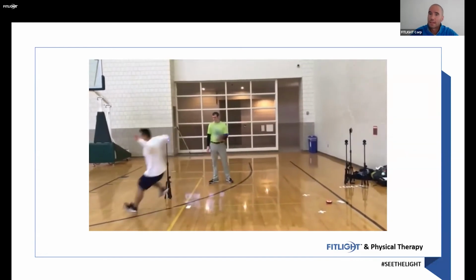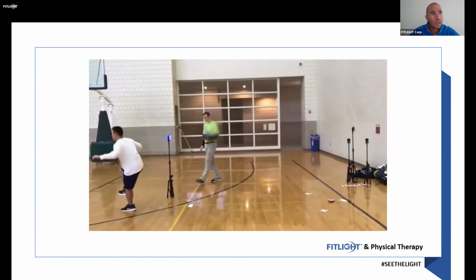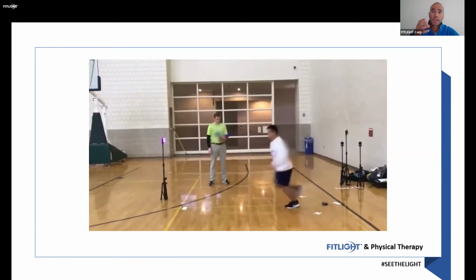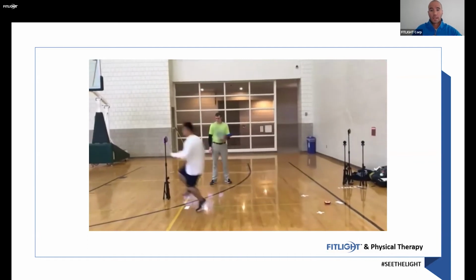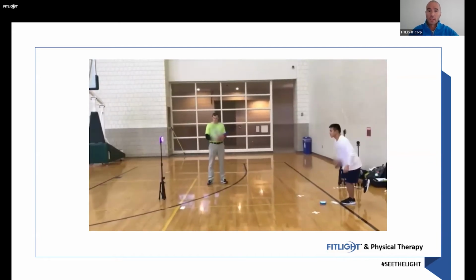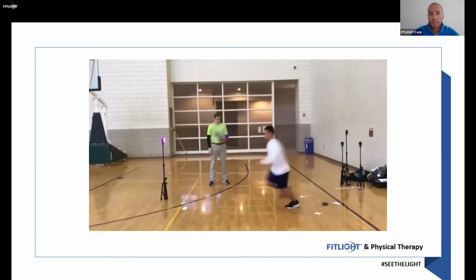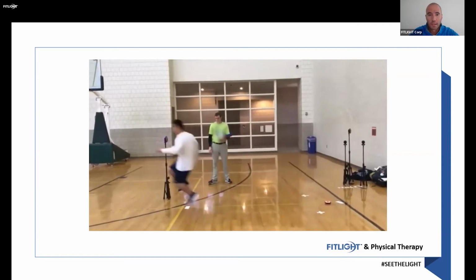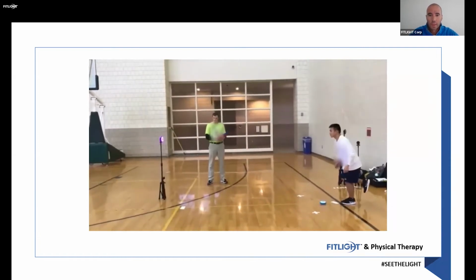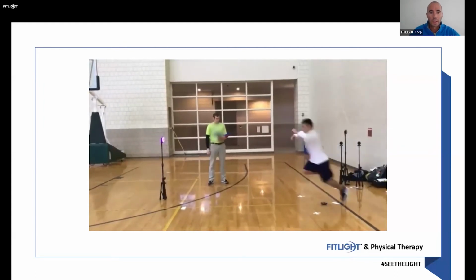And they said the very last task that we do is to have the player look at the moment when he got injured and put electrodes on his body to measure what that does to his body, like if his heart rate goes up, because if it does, he might not be mentally prepared to go into play again. And yeah, this is a good way to see how fast somebody will actually respond to the light.